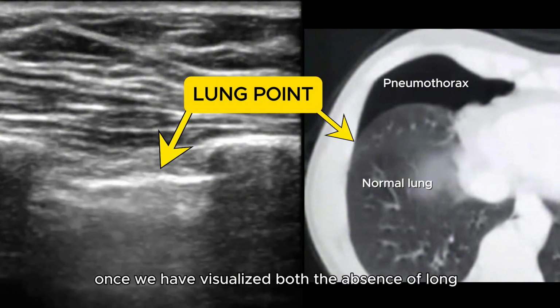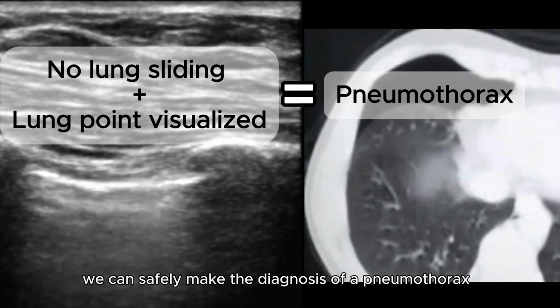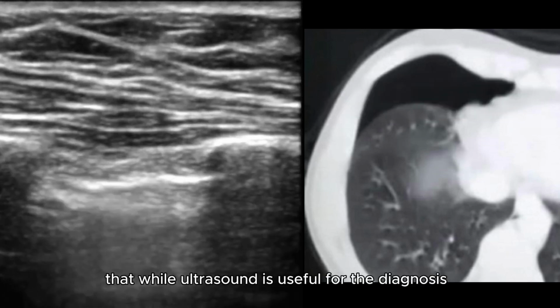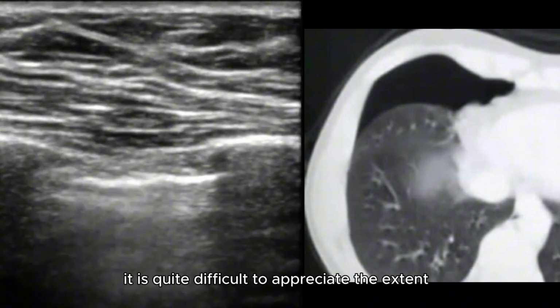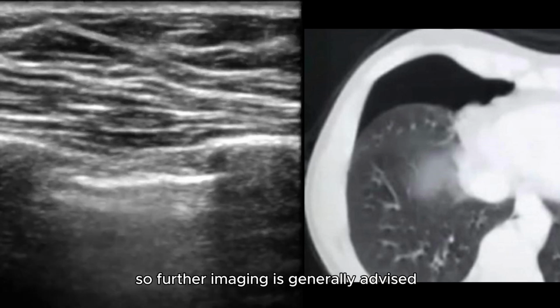Once we have visualized both the absence of lung sliding and the lung point, we can safely make the diagnosis of a pneumothorax on ultrasound. Note, however, that while ultrasound is useful for the diagnosis, it is quite difficult to appreciate the extent of the pneumothorax, so further imaging is generally advised.